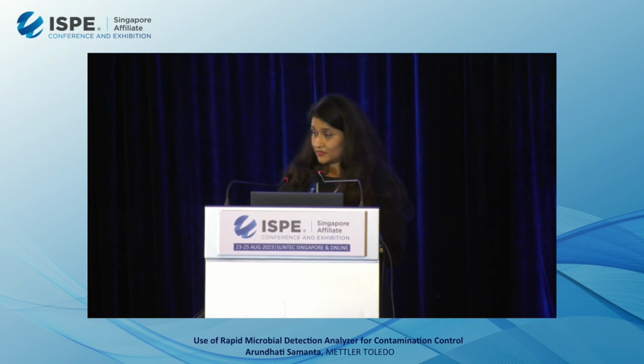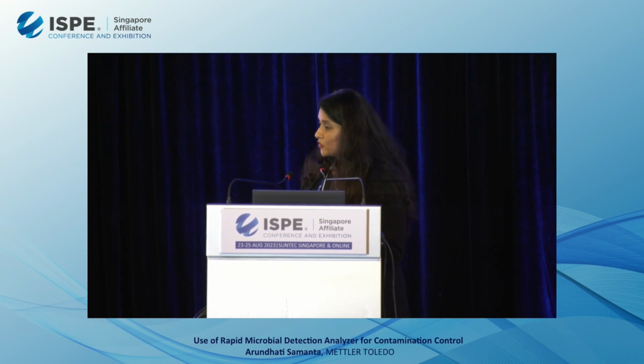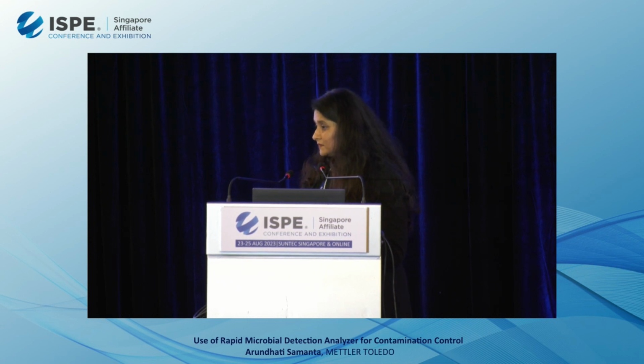Yes. If it's running at ambient temperature. It is meant for purified quality water and also WFI, ambient. It can also be used in hot WFI, but your AFUs will be different. You can use it for purified. We have to validate it for that.